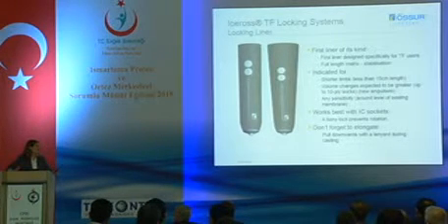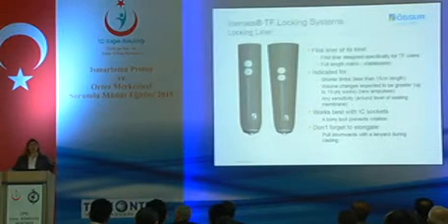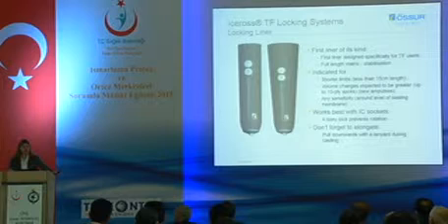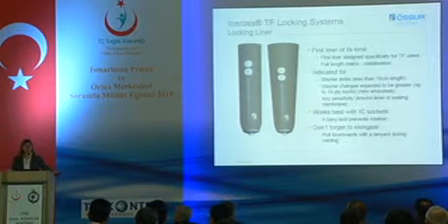The locking liner works best with the ischial containment socket design because we really need that bony lock to control our rotation.